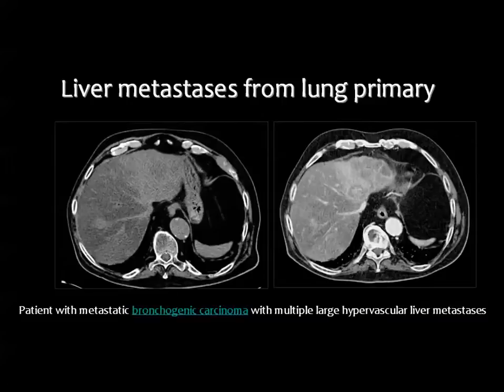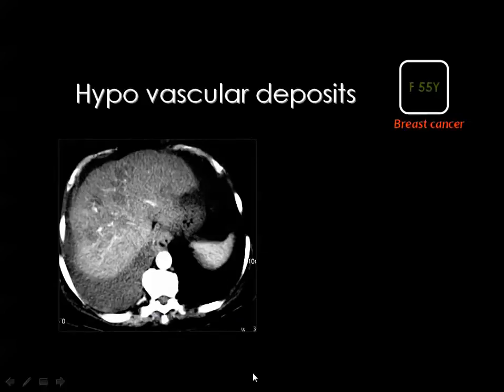And there is a big problem in identifying metastasis in fatty liver. As I have said in the lecture of the anatomy, this is the role of MRI. MRI can clearly identify metastasis in fatty liver, but CT has some difficulties in doing this.